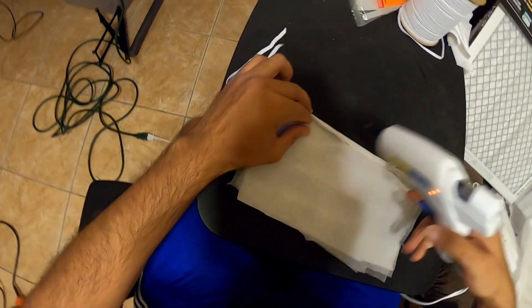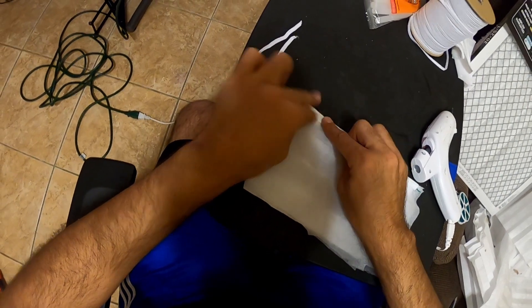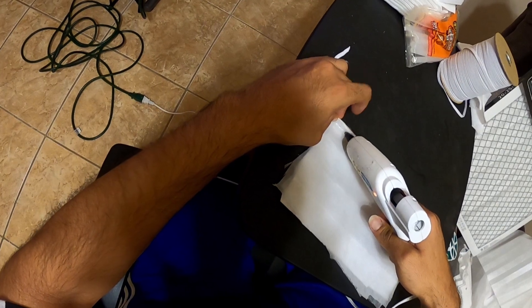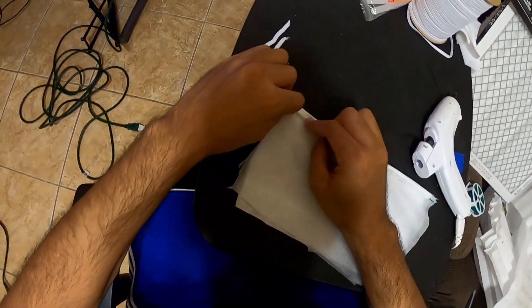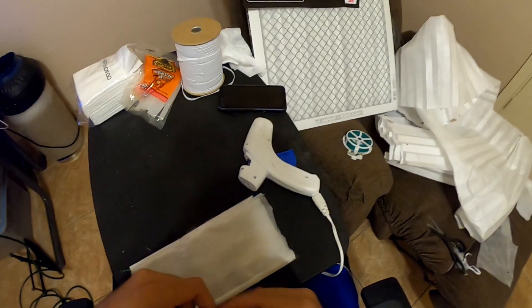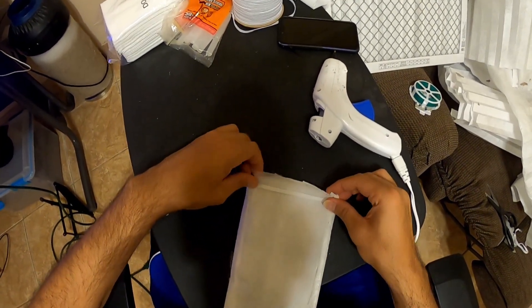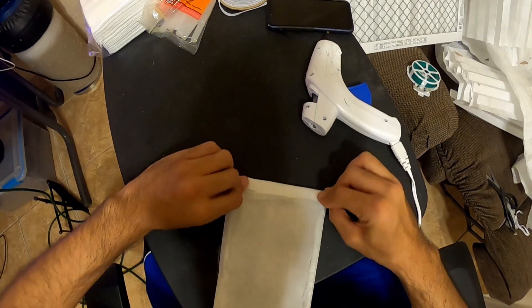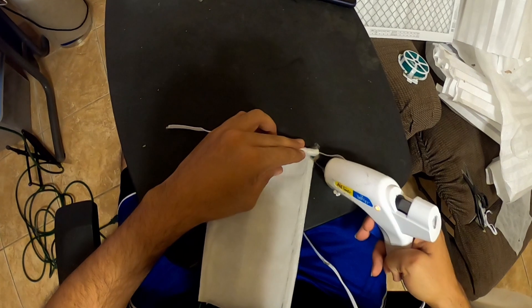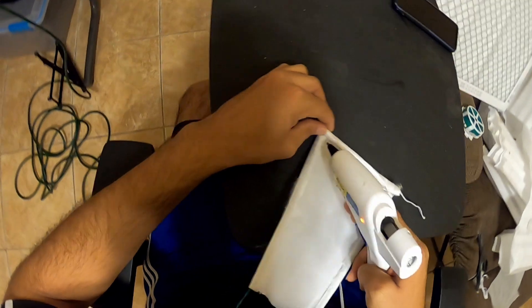I'm going to keep going all the way to the end, and we're going to do the same thing with the bottom part. Now the next thing is to put the elastic band in and rotate it. Good thing these little deals already have the pressure for us — rotate it one more time, then put a little bit of glue here and some glue there.